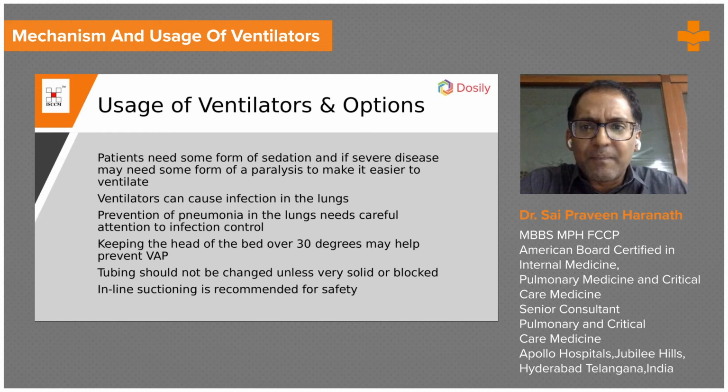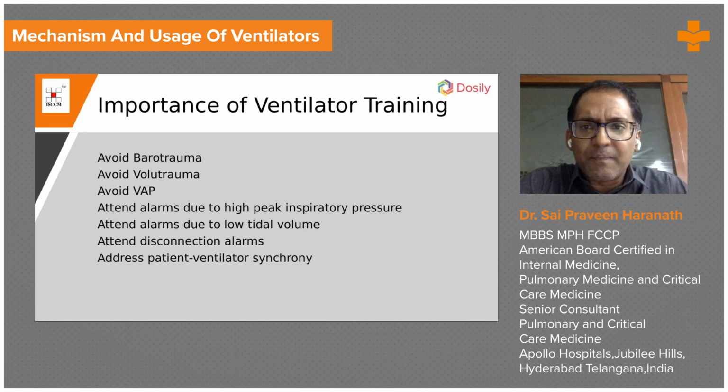Also, for all the tubing that is connected, don't change it unless it's very soiled or dirty. Otherwise, you should continue the same thing, and use inline suctioning, which means do not disconnect the circuit because there is a very high risk of spreading the infection.